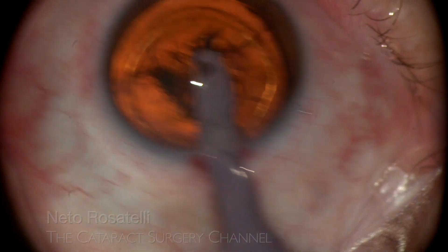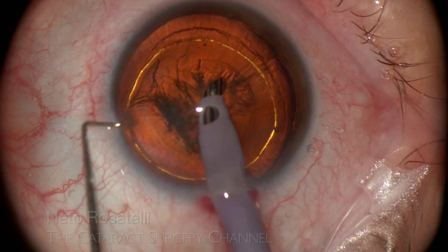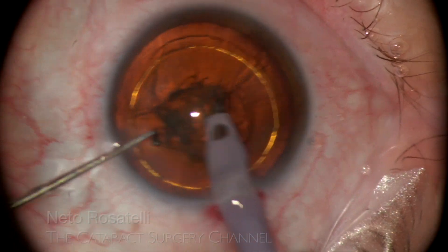After inserting the phaco probe, you can appreciate the reverse pupillary block here, retroposing the iris-lens diaphragm.